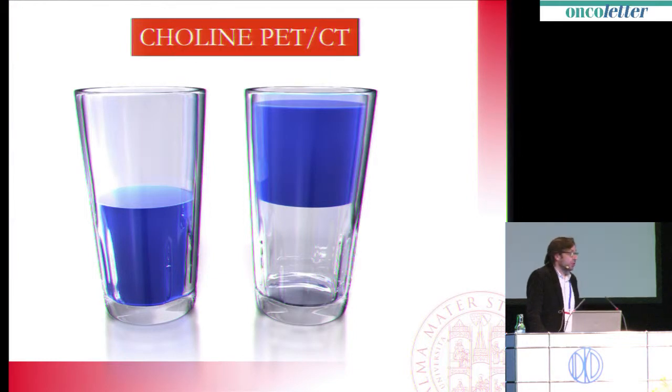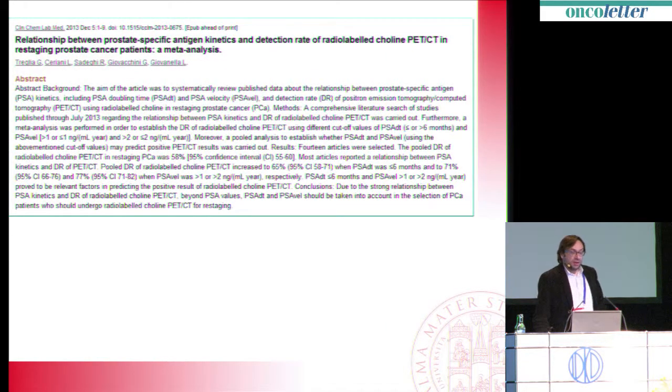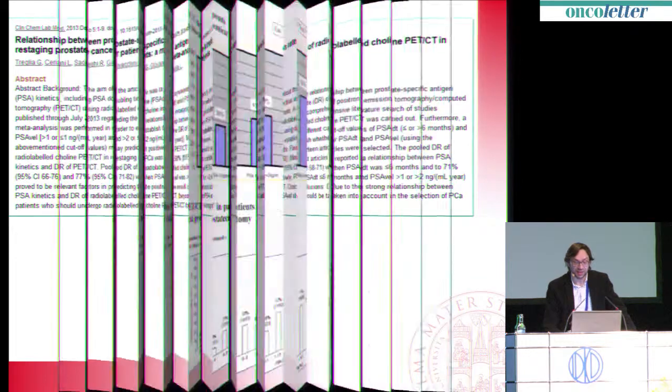So, as a summary, we can consider choline PET-CT as a glass which could be seen as half empty or half full, if you're an optimist or pessimist. The technique is there. Definitely it is not optimal because the accuracy is suboptimal, especially in the prostate bed evaluation. But nonetheless, it is most likely the most accurate method for lymph nodal evaluation and also for early bone detection. One of the major limits is the very well-known relationship between the PSA values and the sensitivity of PET with choline that has been reported for a long time, and there is also a meta-analysis on that.